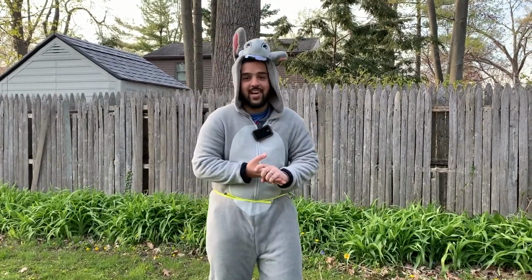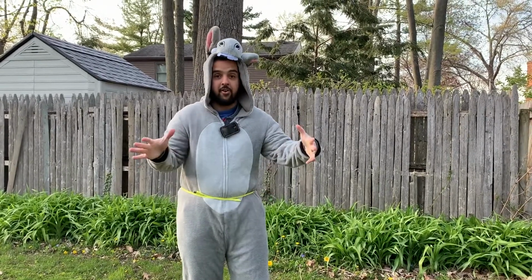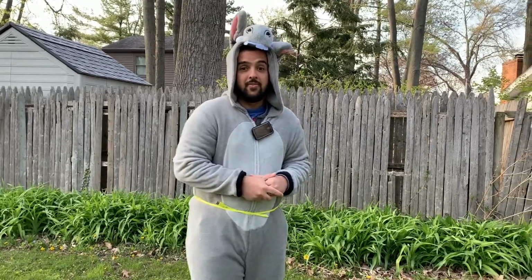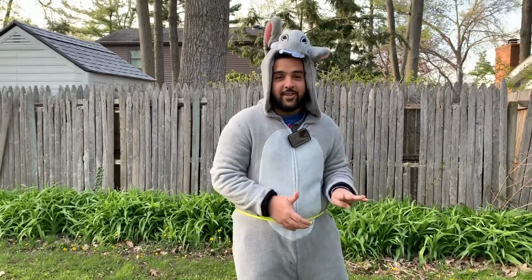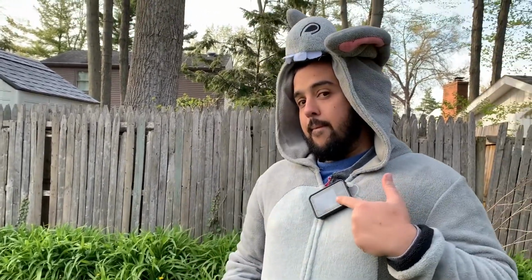So I wanted to talk to you guys about how we're gonna download all our stuff, all our technology before I go to the doctor's office. So there are 3 devices that basically people have, maybe 4. So the first device is going to be an insulin pump or a smart pen. Insulin pump. Second device is a continuous glucose monitor.